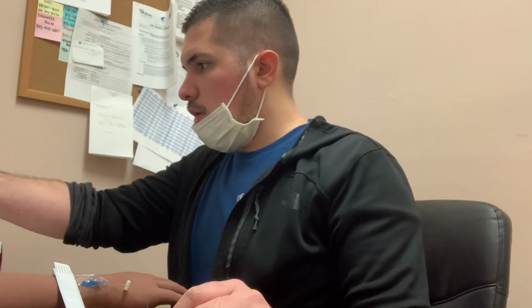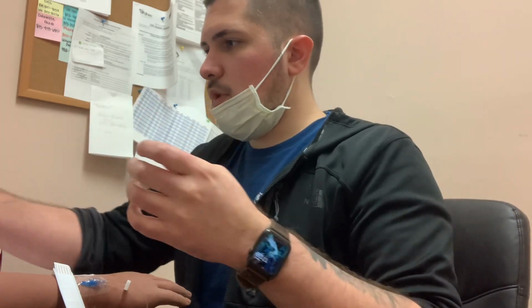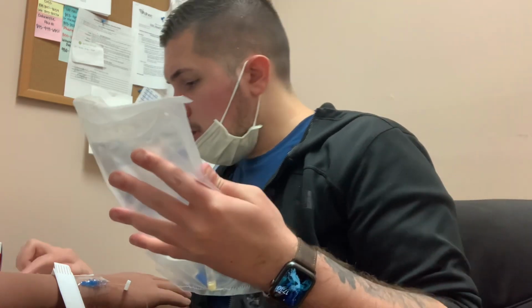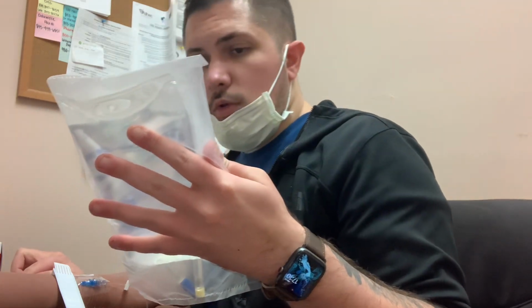So we're going to hand sanitize, and we are going to get our supplies. All right. So we have 500 mLs of 0.9% sodium chloride.